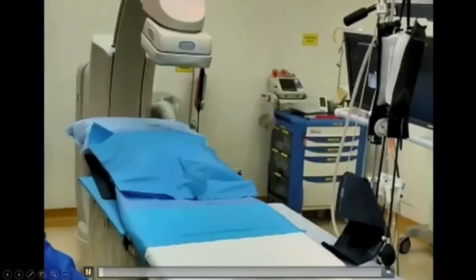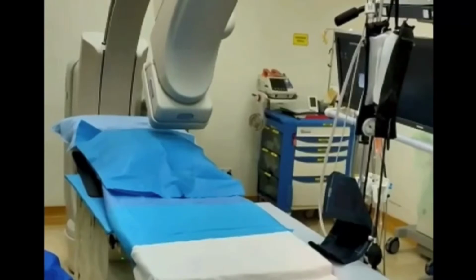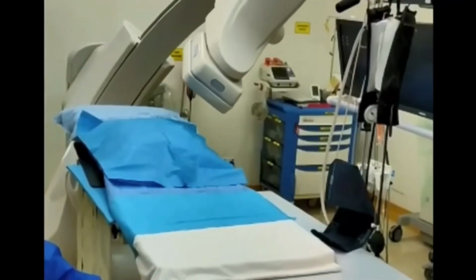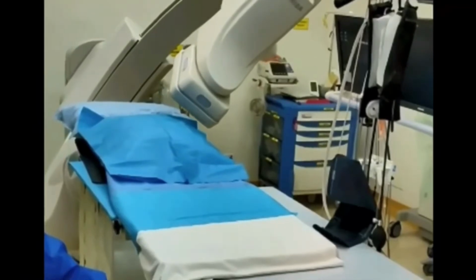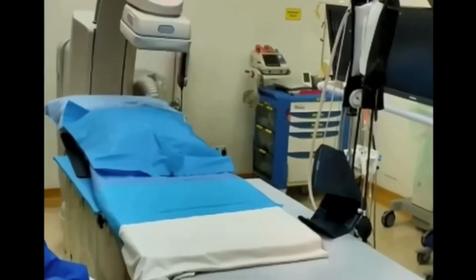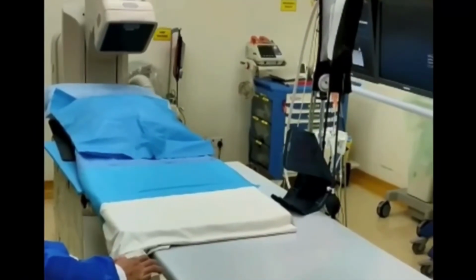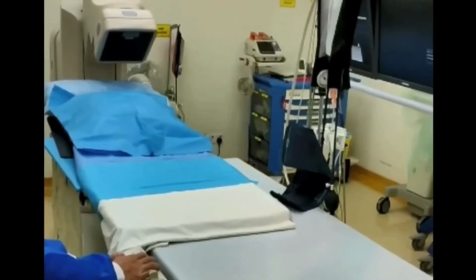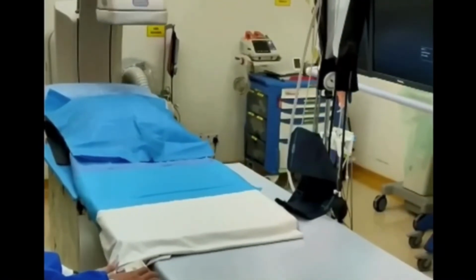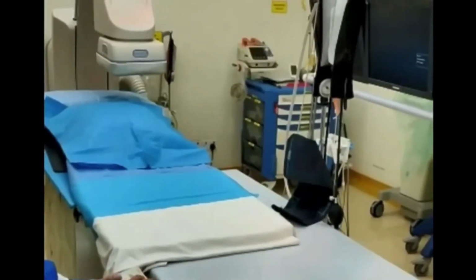AP caudal to study the left circumflex artery. Spider view, the left anterior oblique caudal for the main stem and bifurcation of the left anterior descending and left circumflex artery. Next, AP cranial to study the left anterior descending artery. And lastly, the right coronary artery can be assessed by left anterior oblique and AP cranial view.